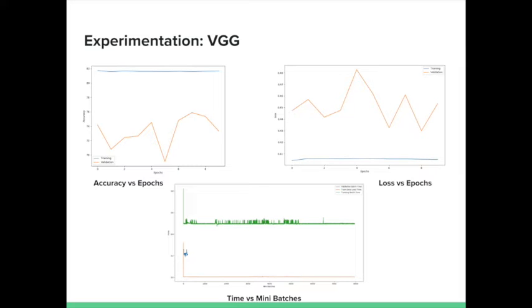Going further, experiments were conducted. We used VGG networks. The graphs are as follows. Based on the hardware constraints, we came up with a pre-trained 11-layer VGG, and the outputs can be seen. Each mini batch time is constant, and the training time required is constant after the first one, which takes time to bootstrap the model. The data loader time is minimized by using an appropriate number of worker threads.